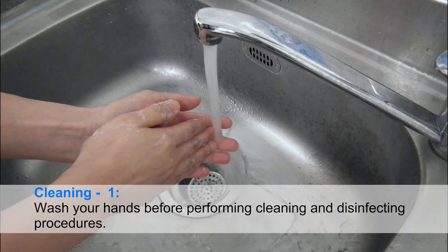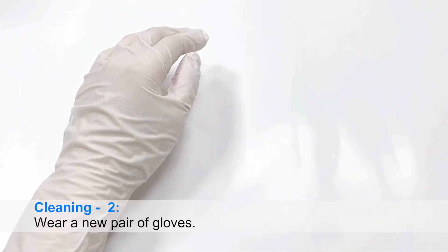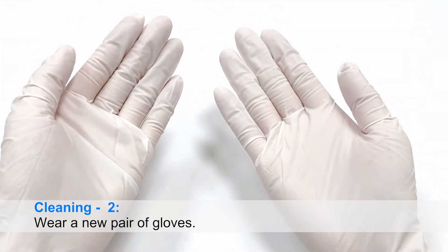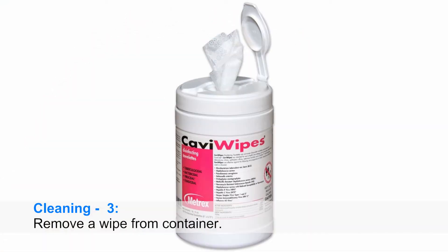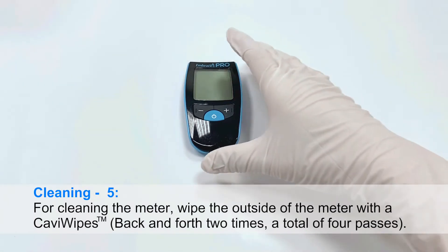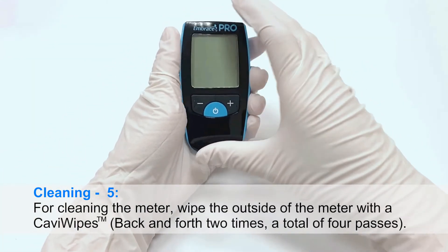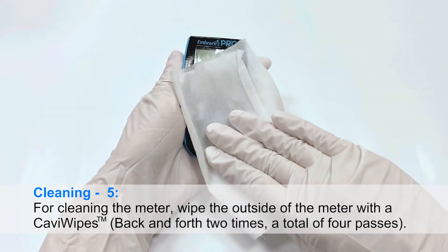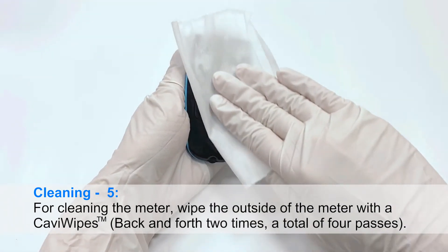Cleaning: Step 1: Wash your hands before performing cleaning and disinfecting procedures. Step 2: Wear a new pair of gloves. Step 3: Remove a wipe from the container. Step 4: Check if the meter is turned off. Step 5: Wipe the outside of the meter with CaviWipes, back and forth two times — a total of four passes.